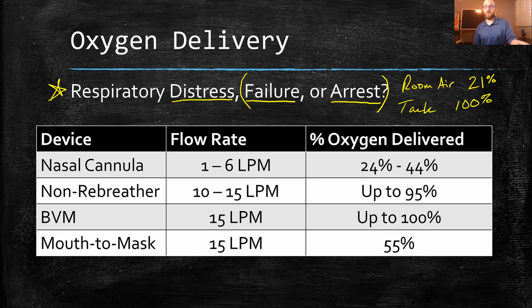So it's really for that patient who is still breathing quite well on their own. We just need to supplement their oxygen just a little bit. That's why they call it supplemental oxygen. It says, you're breathing all right, but let me give you a little bit extra oxygen.